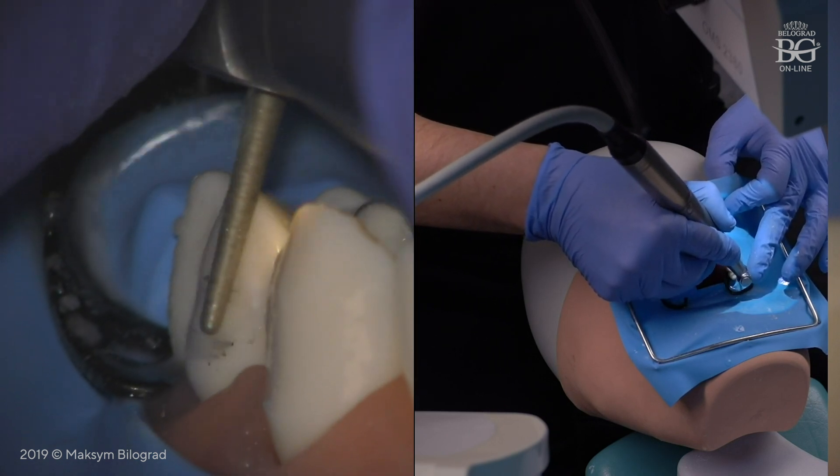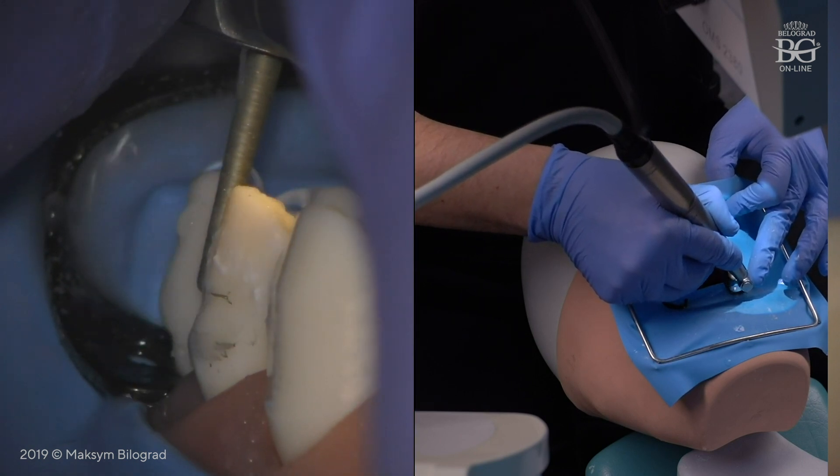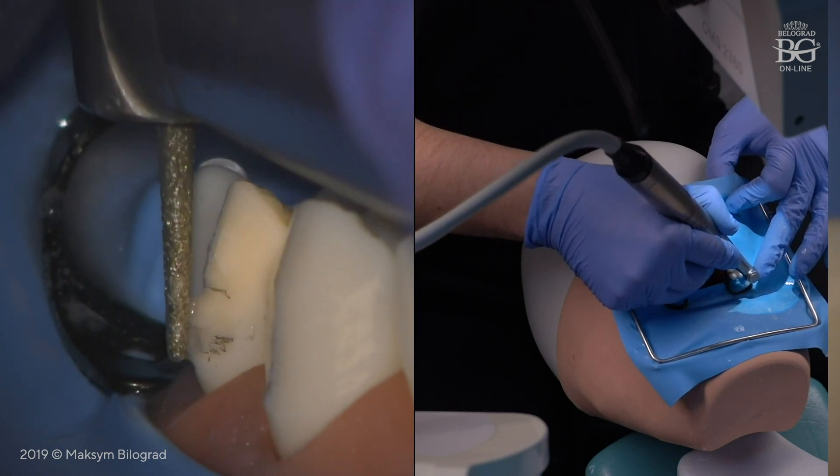Once the incisal plane is prepared, we will start preparing the second plane. We put our burr parallel to the bulbosity — to the most bulky part of the tooth.